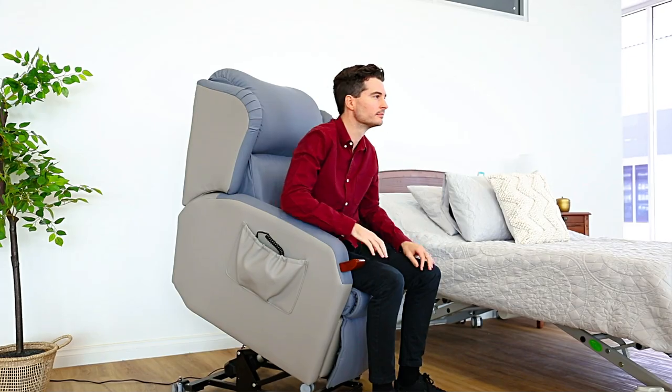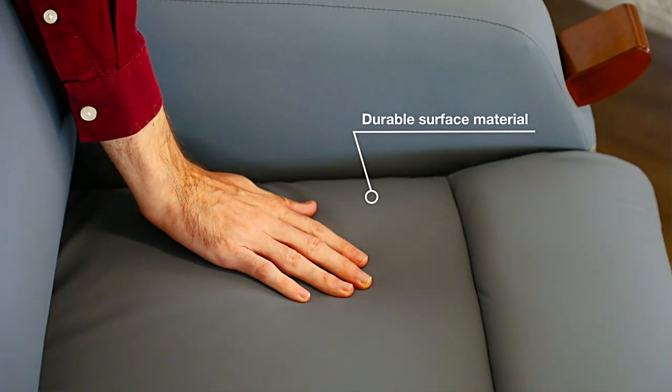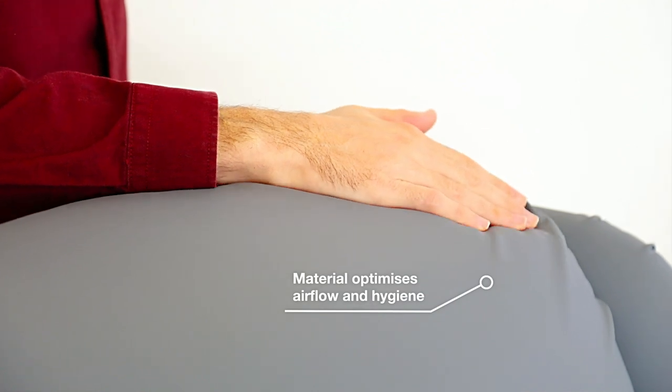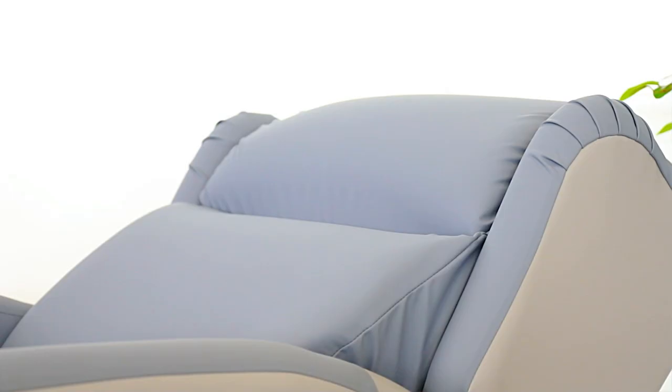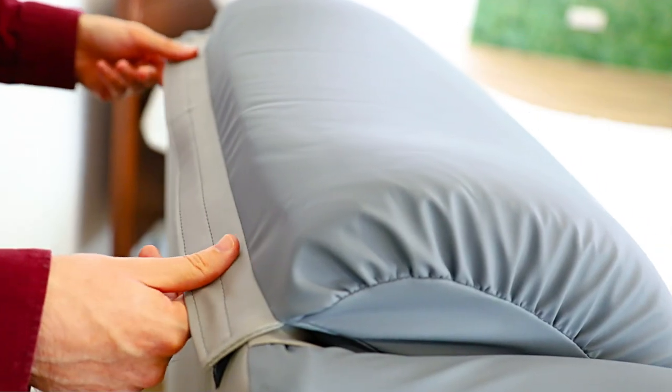The intuitive rise and recline function makes getting in and out of the chair safe and easy. The seat's durable surface material is designed to stretch, offering less shear and improved pressure-reducing properties. The material also optimizes airflow and hygiene, being antimicrobial and antibacterial.